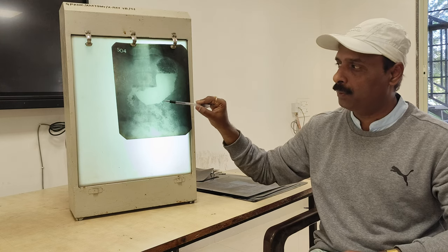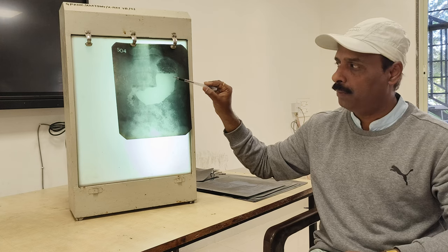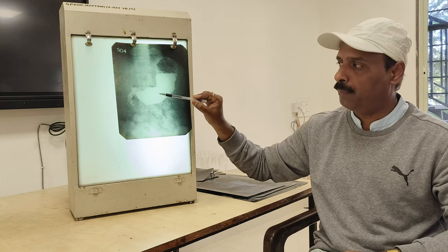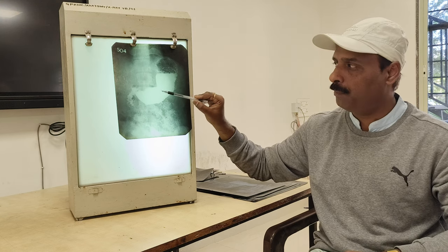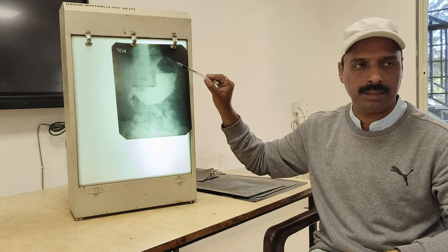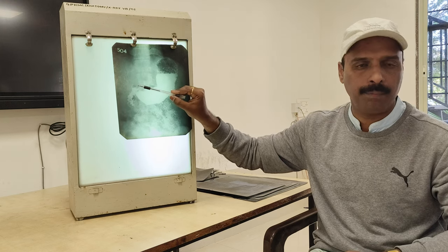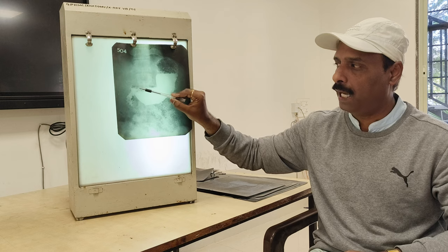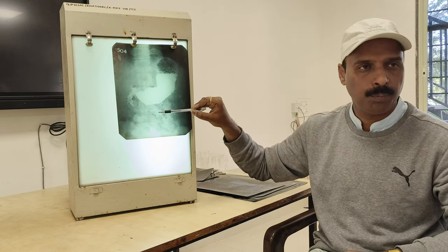Here all the parts of the stomach are seen. You can see the fundus of the stomach, body, pyloric antrum, pyloric canal. We have the pyloric canal, pyloric antrum, body and fundus. And here we have the duodenum and duodenal cap. The duodenum and duodenal cap are normal. And this is the small intestine.